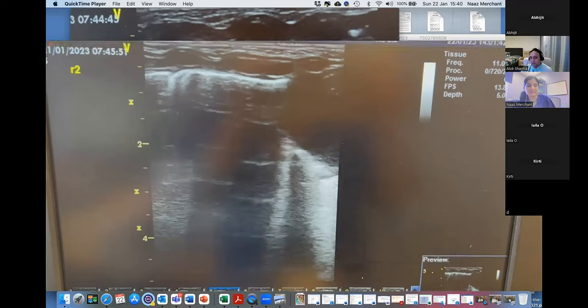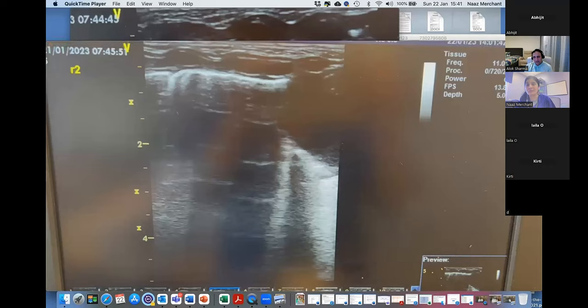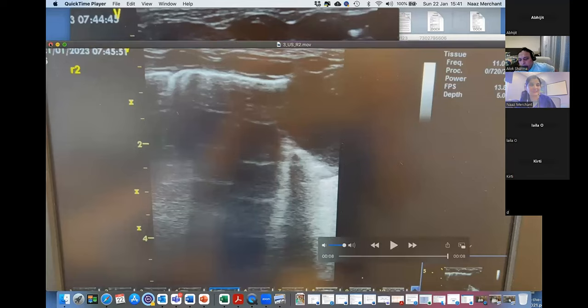Again, the question from our perspective is that this would need further follow-up. Is this an area of patchy atelectasis where your endotracheal tube wasn't down the right side, was it? No, in fact, the X-ray shows exactly where we left it. It's quite high up, actually, at T2, T1. T2. So again, in babies who are intubated, seeing consolidation or atelectasis on the right side immediately after intubation might prompt you to have a look and see where your tube is, just because you might be collapsing the upper segmental lobe. Can we go back to your last image?